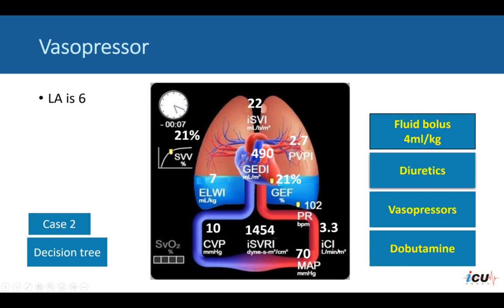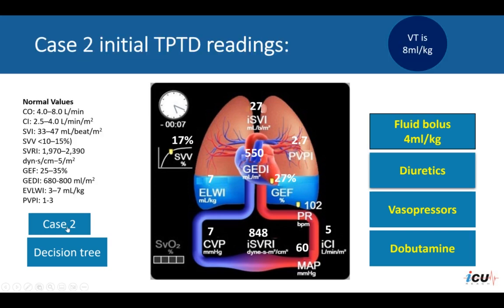His cardiac index is decreased, so probably the patient was given neosynephrine. Heart rate did not go up much or stayed the same. So the answer would be not to give this patient a vasopressor alone. What this patient needs is a fluid bolus. So let's go back to the baseline.